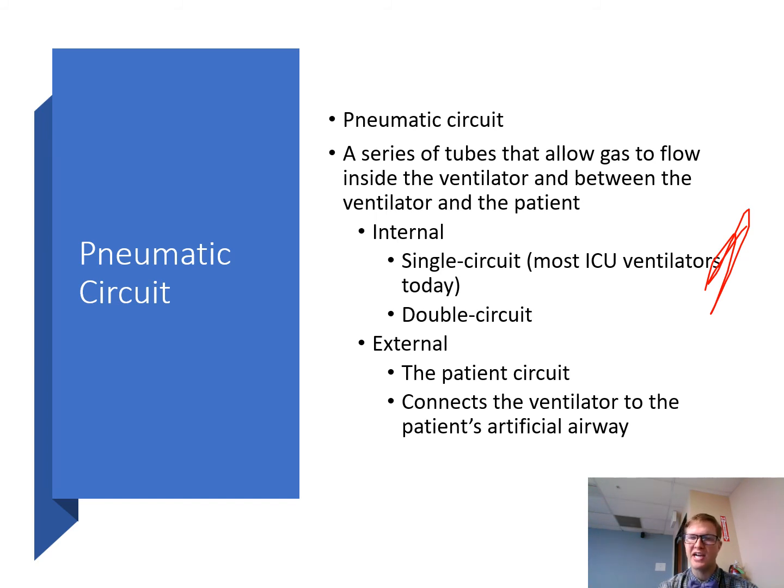In most current ICU ventilators, the exhalation valve is on the inside of the ventilator and is not visible, but a mechanical device like a solenoid valve typically is used to control these internally mounted exhalation valves. So when we're looking at most of these, a lot of them will be internal.